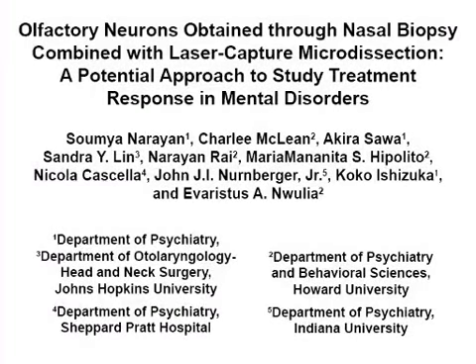This procedure details the use of laser capture microdissection to isolate neuronal layers from the olfactory epithelium tissue and also outlines some downstream gene expression analyses.